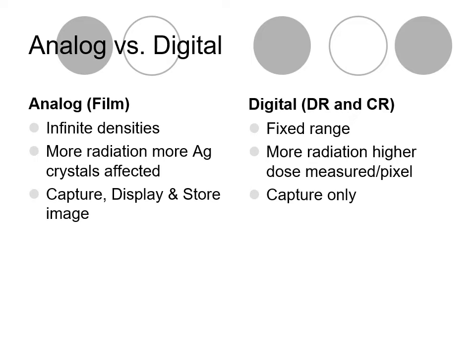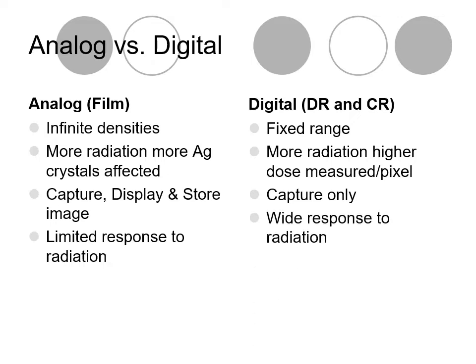Density change for film screen systems is very limited. Over or underexposure by a factor of 2 times demanded a repeat exposure. Underexposure can still require a repeat exposure for a digital system, but overexposure of 8 times or more can be corrected by most systems. This leads to concern over the mentality of using more radiation than is necessary to perform an examination.